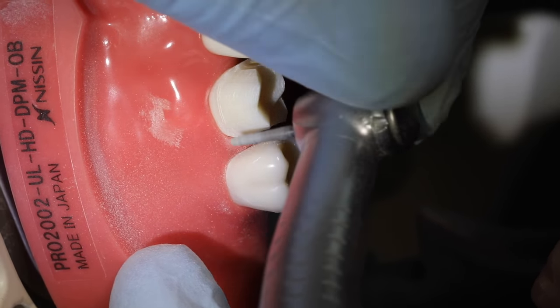Okay, we're getting very close. A little refinement on our distal axial wall. That lingual looks good. And put our burr back in. We're going to come over this way a little bit. And it was on the distal that I needed to refine that a little bit. Hold on one second. Okay, we'll refine our functional cusp bevel now a little bit.